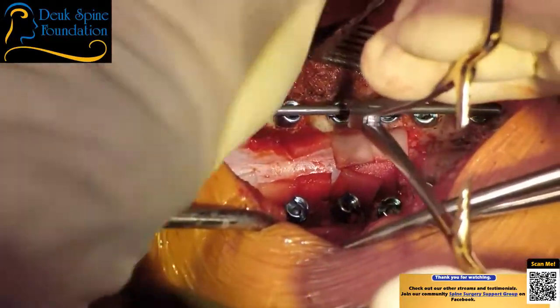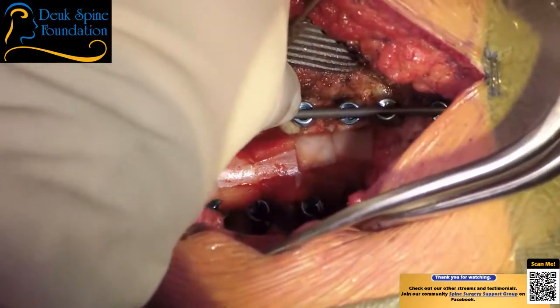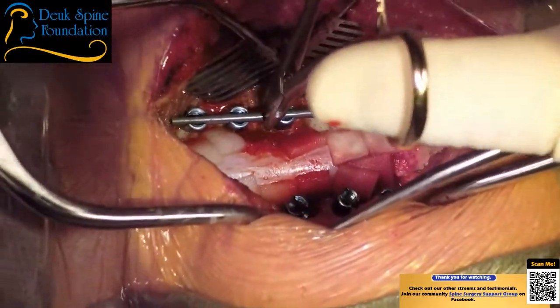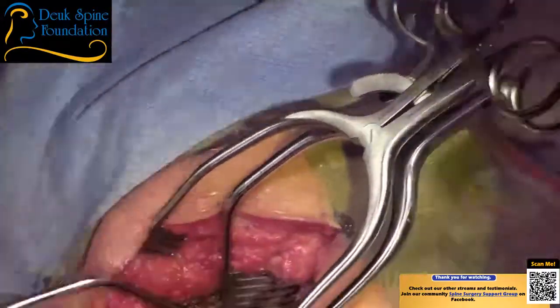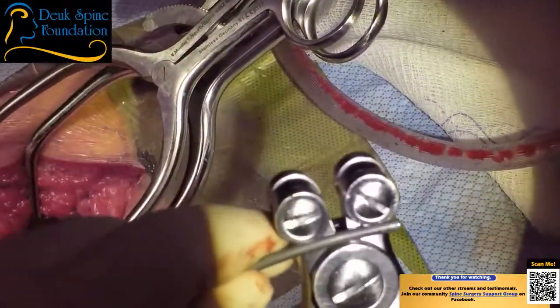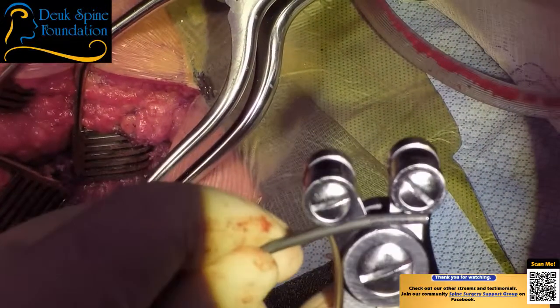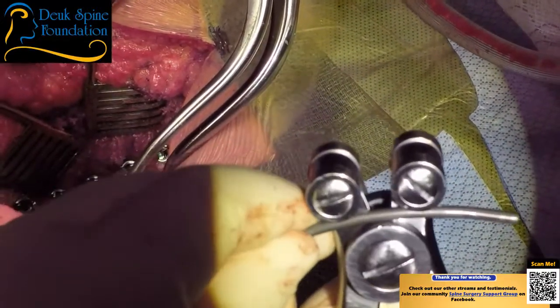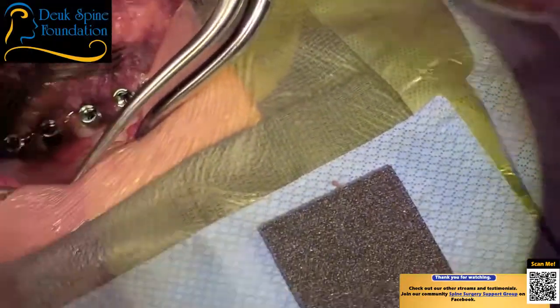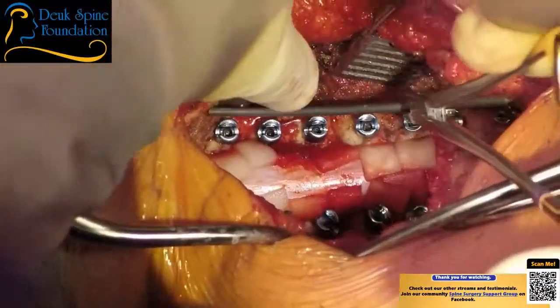All right, we're just about done. This contour looks pretty darn good. What I don't want to do is create kyphosis. So I want there to be a little bit of distance between the bottom of the rod and the tulip head, so that the spine comes back to it, so that we get a little more lordosis. Now we're instrumenting from C3 to T2.